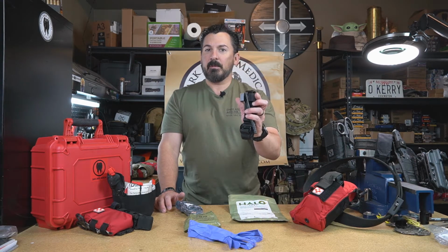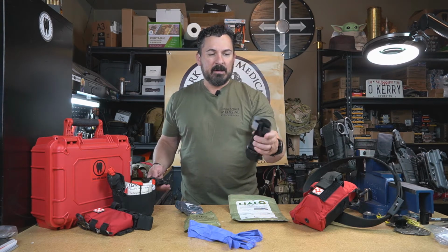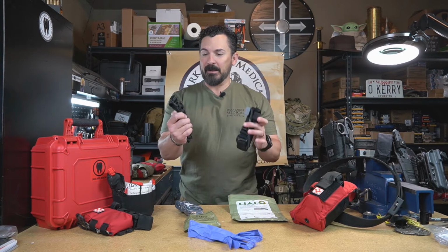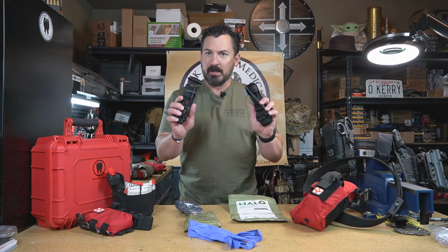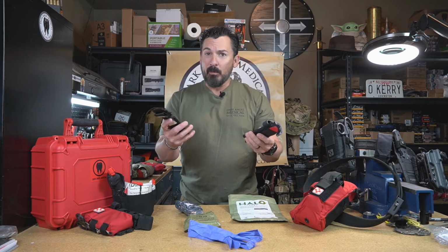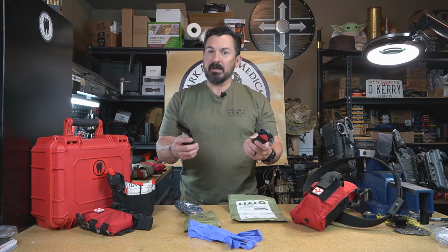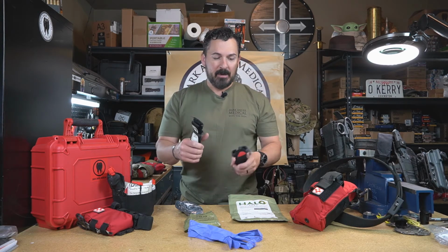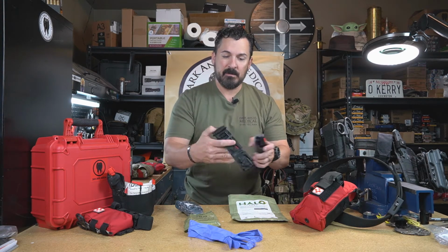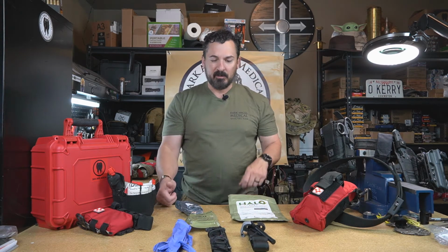Now, tourniquets. Okay, so this is the North American Rescue CAT Gen 7. And this is the Tactical Medical Solutions SOFTT-W. This is like their Gen 5, the latest one that's out there. Either of these, TCCC recommended tourniquets, and you'd be solid with that. So if you can carry more than one tourniquet, cool, do it, because some people may need more than one tourniquet to stop that bleed if the limbs are bigger, bigger diameter extremities, things like that. So tourniquets are my next one. So gloves, tourniquets, and the reason I say gloves first is because universal precautions. We have to protect ourselves from those bloodborne pathogens.